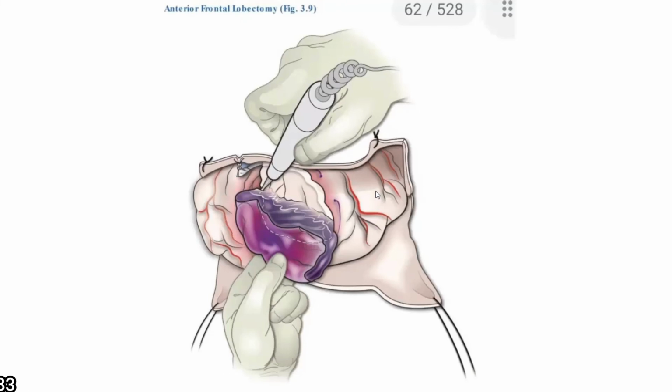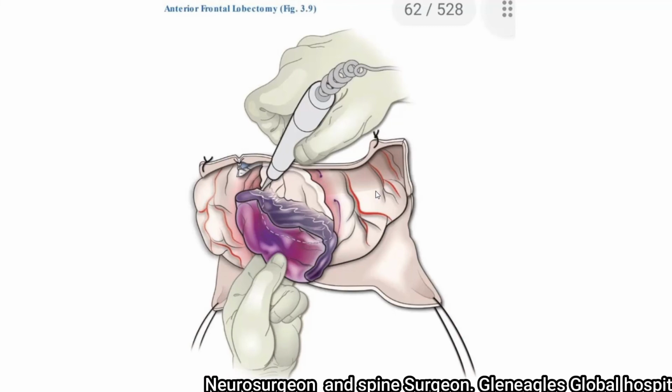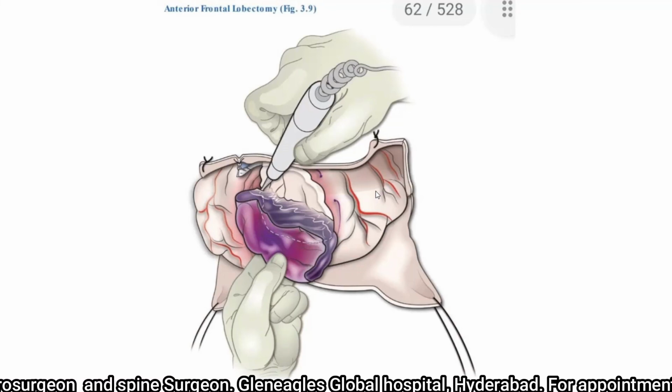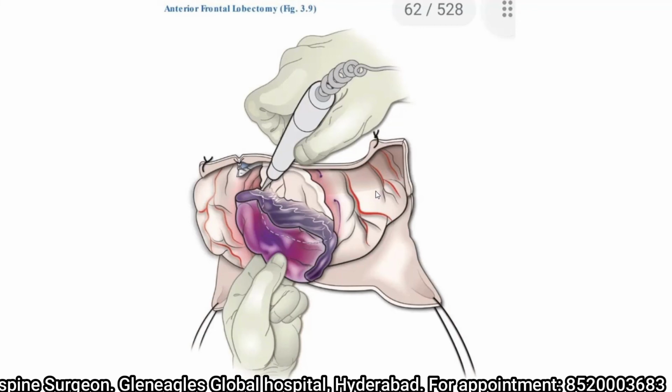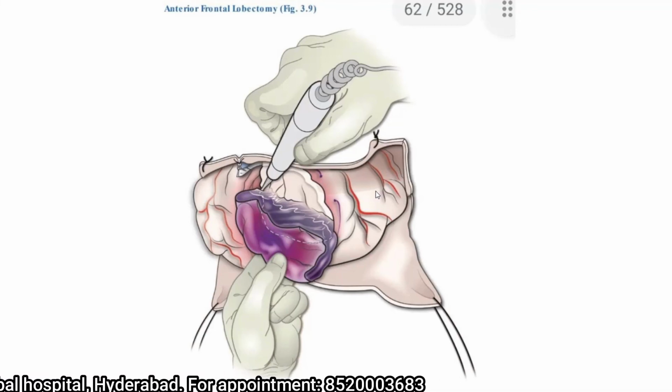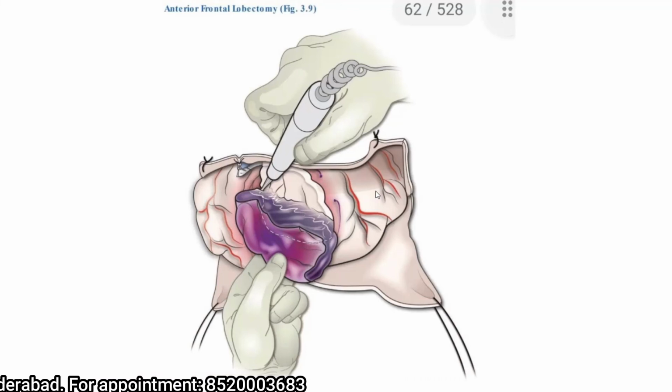So once I achieve hemostasis, the next steps are similar to my previous session. You decide whether you want to do a primary duroplasty or an expansile duroplasty, or just tack-up sutures augmented with Abgel. You decide whether you are going to replace the bone flap or preserve the bone flap elsewhere. Achieve hemostasis, place a closed suction drain and close the skin in layers.